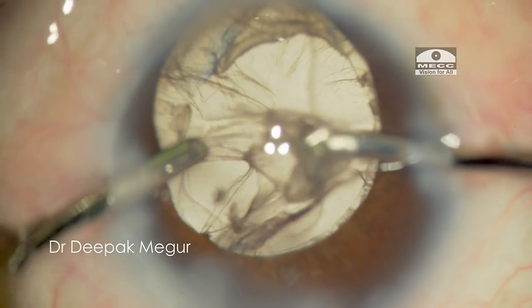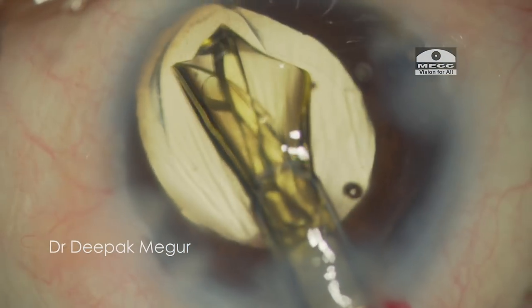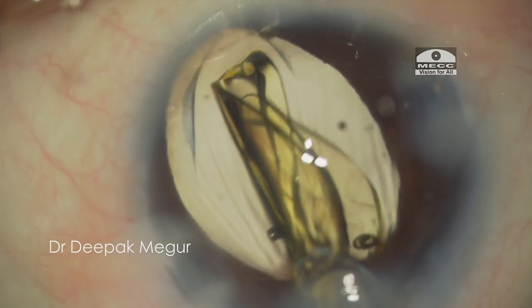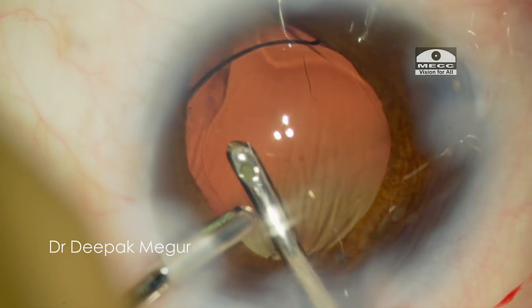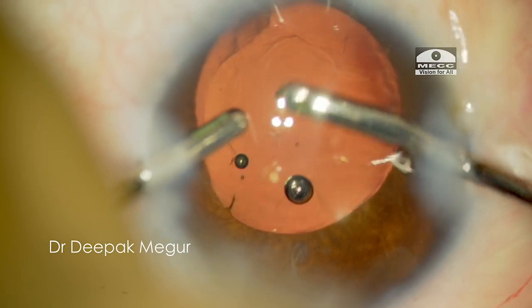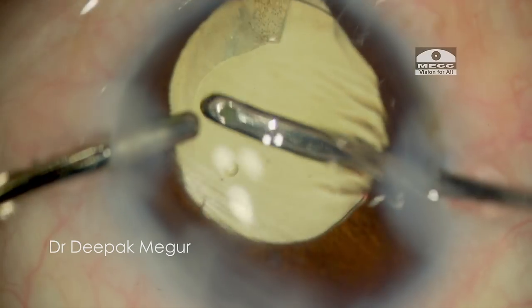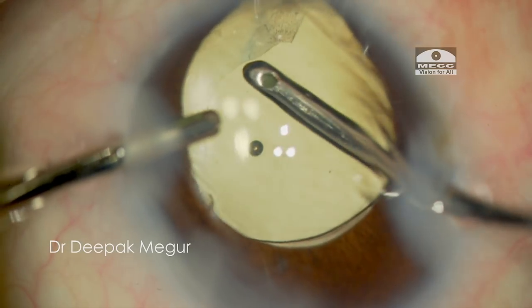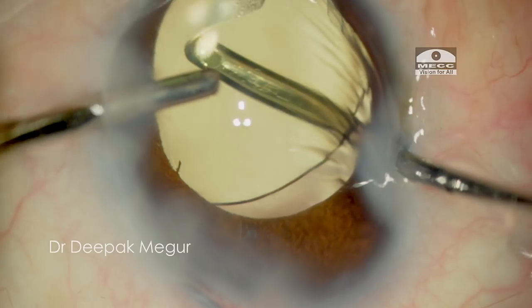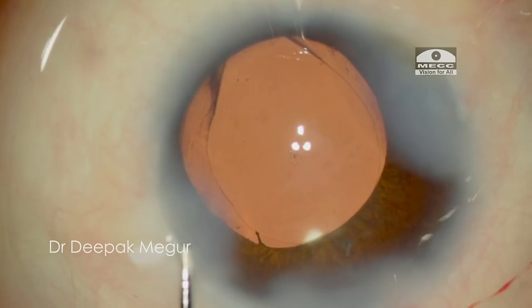The cortex is then easily peeled off, the bag is formed with viscoelastic, and a single-piece intraocular lens is placed in the capsular bag. The 6 mm optic appears quite large relative to the size of the capsular bag, emphasizing the smallness of the capsular bag. The OVD both in front and behind the lens is removed, and the intraocular lens is oriented so that the haptics are at right angles to the plane of the torn rhexis.